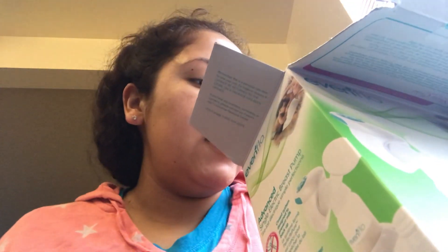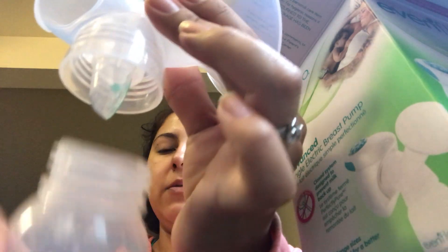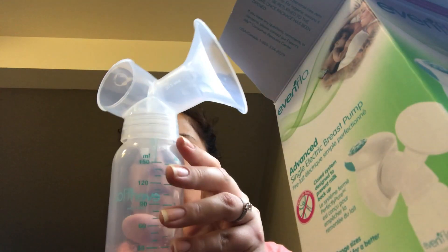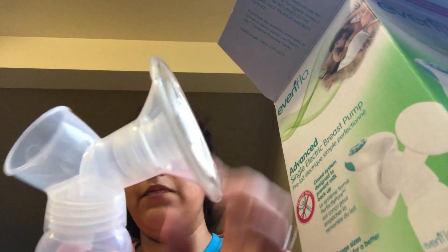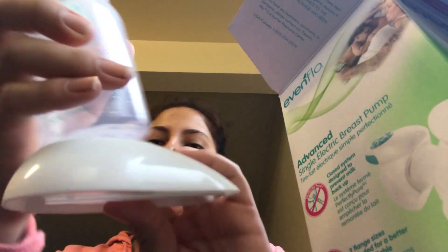And then it comes with this flange that's already attached, so you can't unattach this one. This is the little part that you attach at the bottom in order for the milk to flow down into the cup — so basically it goes like this. And then if you want to use this one, you have to insert it in here — just pop it on there, like that. If it's your size, you leave it like that. And then it also comes with this stand piece.